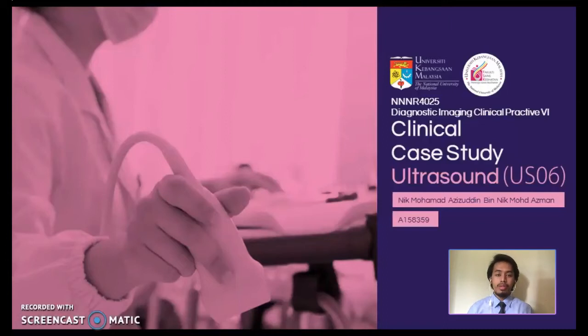So today I am going to present a clinical case study of ultrasound. The code is US06 and let's start.